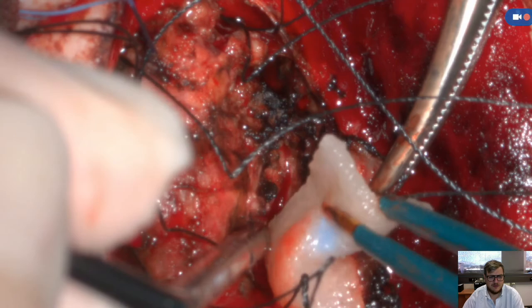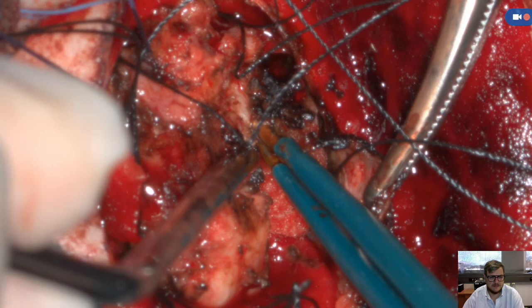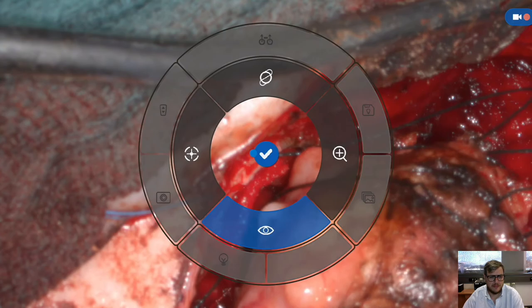So you feel comfortable quite quickly with that. There is further detachment by coagulation of course. Now the tumor is quite loosened and circumferentially dissected.